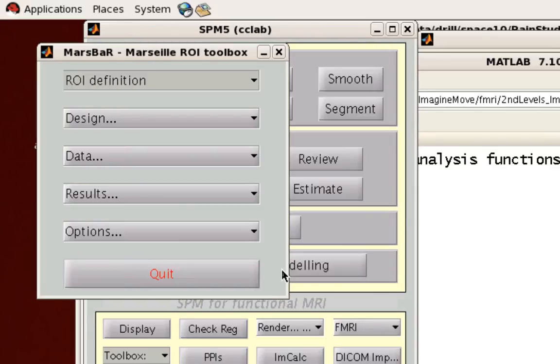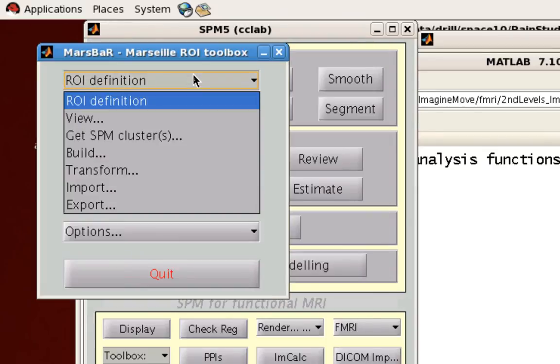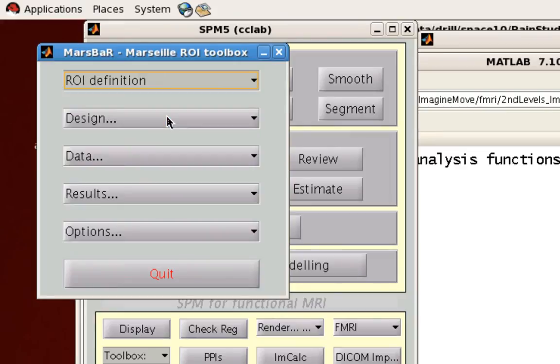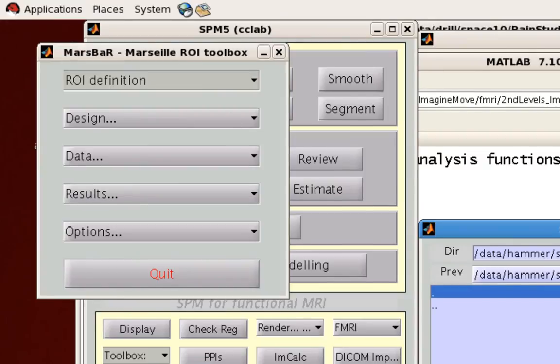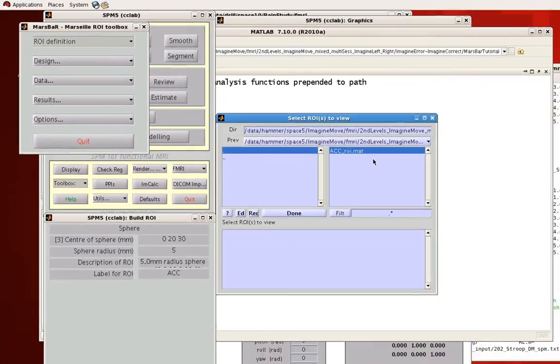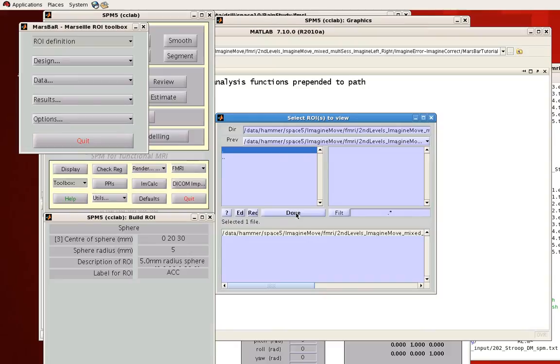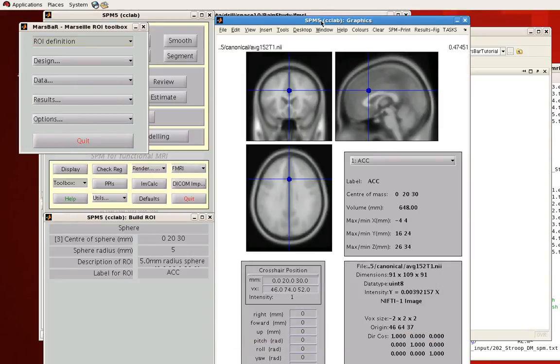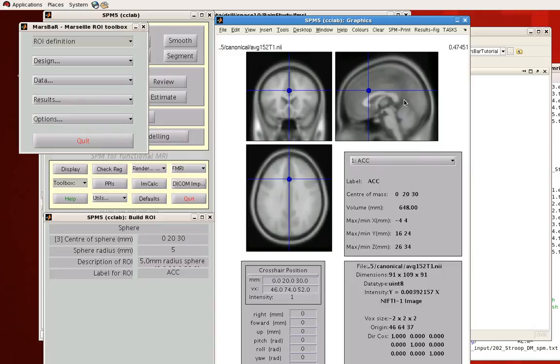And once you've done that, it's good to, first of all, view what you've just output. So again, from ROI definition in the MarsBar menu, click on View. And load up this recently created acc.mat file. And click Done. So if you click on the SPM5 graphics window, you'll see in blue, this is the sphere created by the MarsBar ROI program.